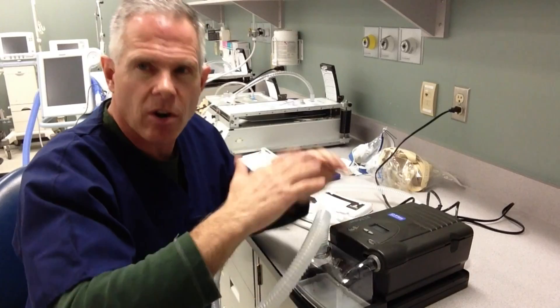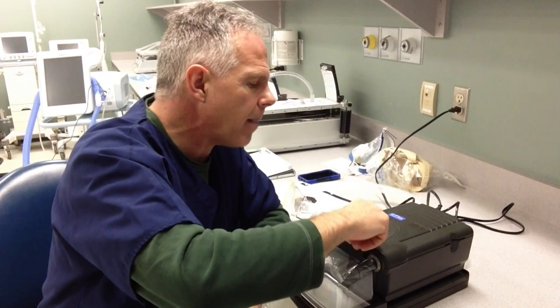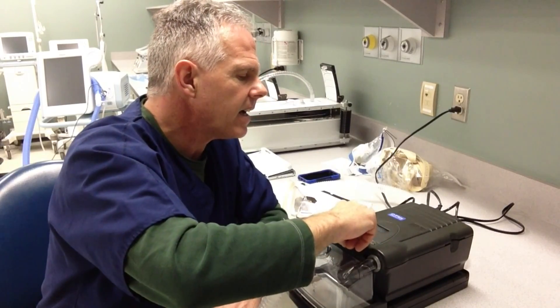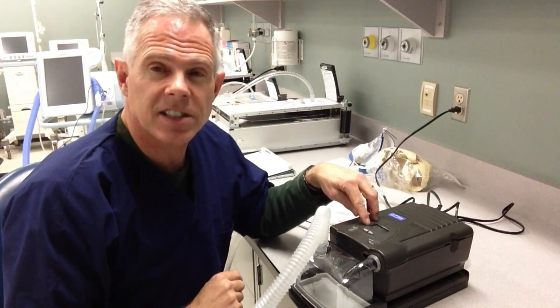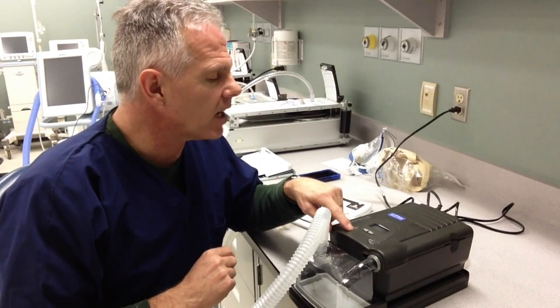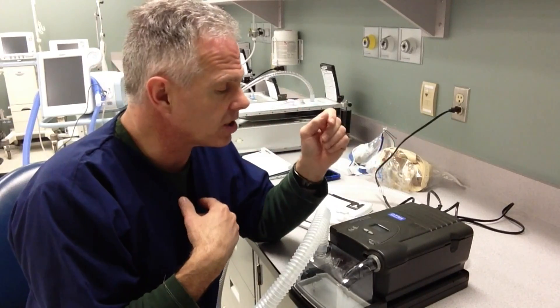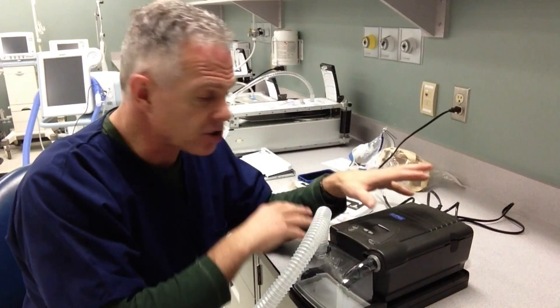It could be C-Flex, which automatically adjusts a little bit for the patient, or we can just set the CPAP level being delivered to the patient. We adjust it so we can see CPAP flashing in the window, and then we can adjust the level we want by using these other two buttons right here. I'm going to pick six just for our demonstration today. That's all there is for the initial setup.